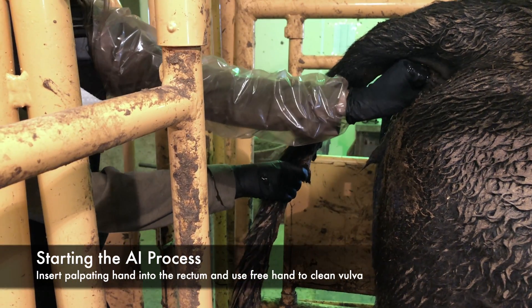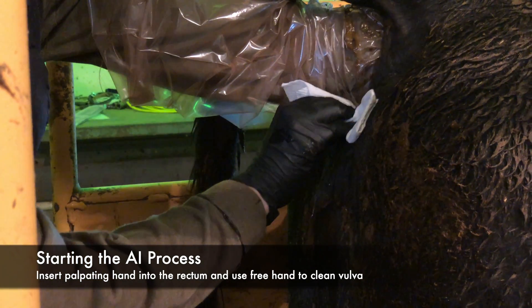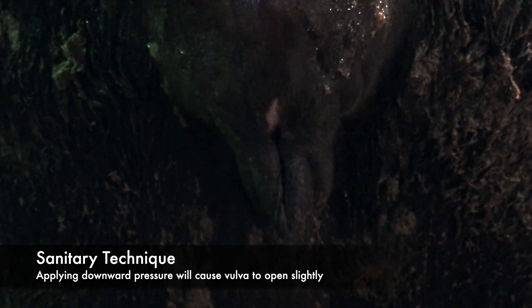Point your fingertips to your thumb and insert your palpating hand into the rectum. Wipe the vulva of any manure in order to avoid bringing in infectious bacteria. Making a fist and applying downward pressure will cause the vulva to slightly open, allowing a clean entrance.